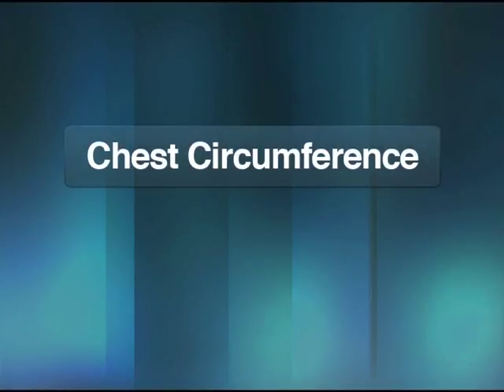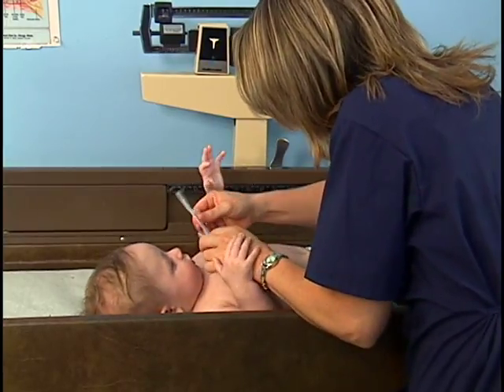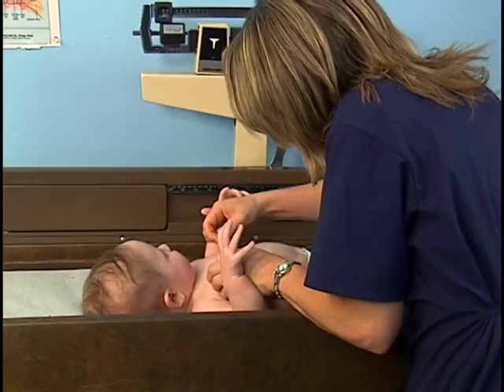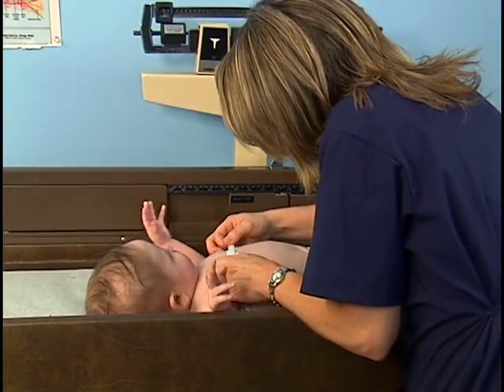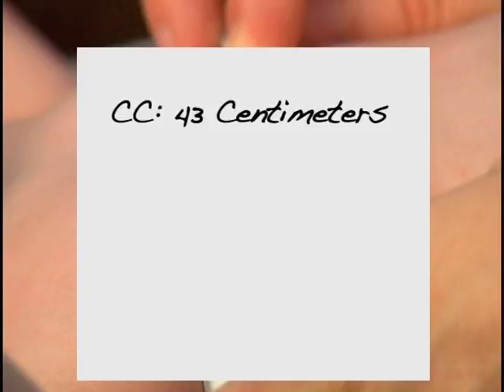Occasionally, your physician may want you to measure the infant's chest circumference. The medical assistant will first show you how to measure chest circumference in centimeters using a pediatric circumference band. Position the infant on his back on the examining table. Place the measuring band around the infant's chest at the nipple line. It should be snug, but not so tight that it leaves a mark. Read the results at the read mark in centimeters to the nearest 5/10 of a centimeter. Jonathan's chest circumference measures 43 centimeters. Jot down this value or make a mental note of it.